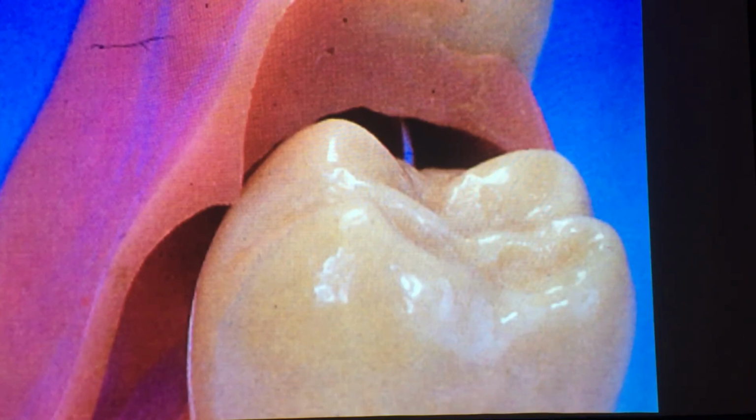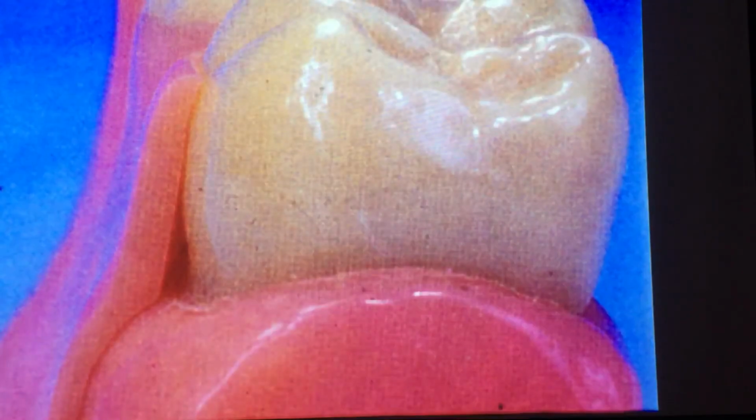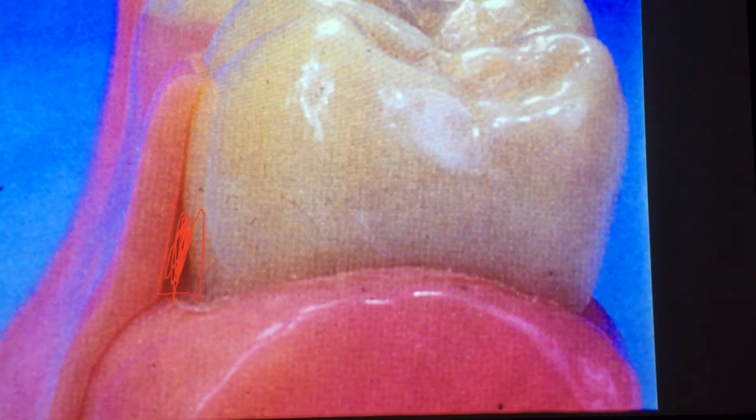In plastic, a little bit easier. Take your burr, adjust this section here. That's binding on the abutment tooth. It's transitional, tissue supported regardless. And then the next picture, you can see it slide down. Okay, this is a simulated model, but what I'm trying to simulate with these pictures is this undercut right here that I'm going to mark in red. This is what I relieved. Here's what you'll block out in chromium cobalt, so we don't have to relieve it, or at least not relieve it as much.